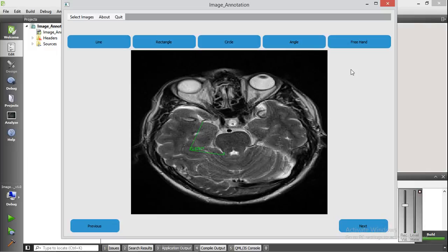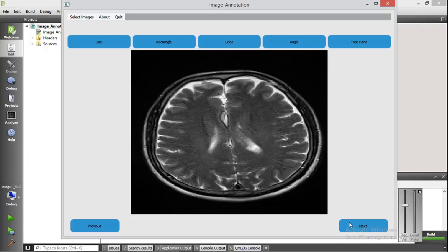You can also annotate this image with an arbitrary shape using freehand. You can draw any kind of shape. Let me go to the next image.